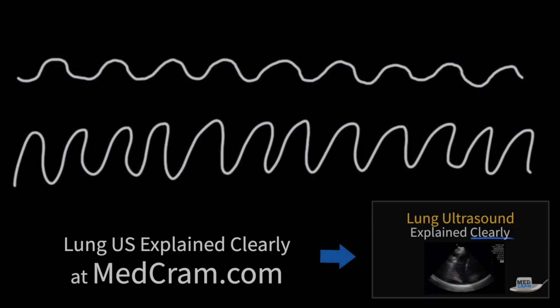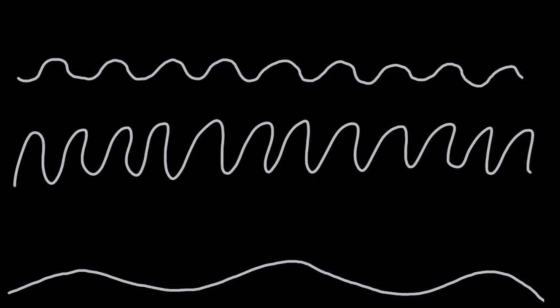Okay, to make sure we understand these characteristics of sound waves, I want to do a few examples. We're going to compare these various sound waves. If we compare the top wave to the middle wave, we'll notice the wavelength of the top wave is longer compared with the wavelength of the middle wave. Therefore, since the wavelength is longer, the frequency is going to be lower, and the pitch of the top sound wave will be lower than the middle wave. If we look at the amplitude, the top wave is lower than the middle wave. Therefore, the volume, or the amplitude, of the top wave will be quieter than the volume of the middle sound wave.